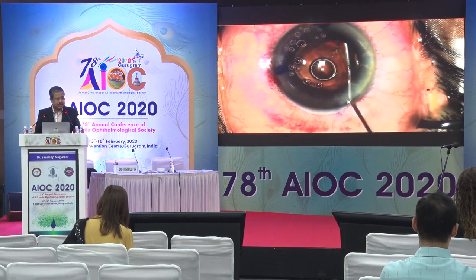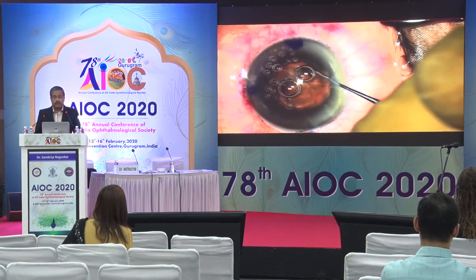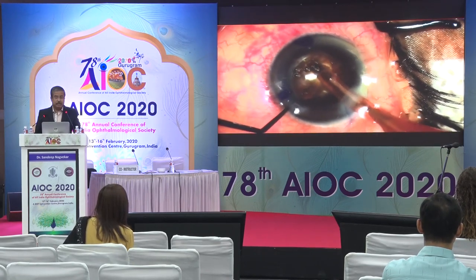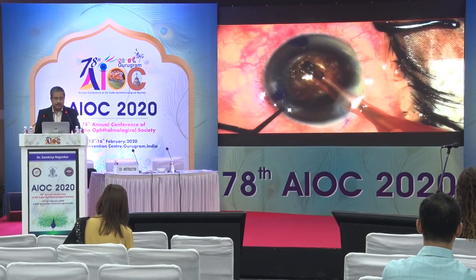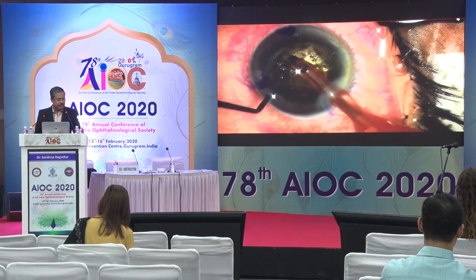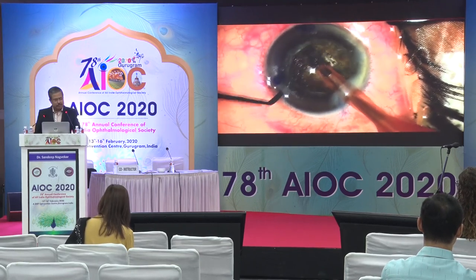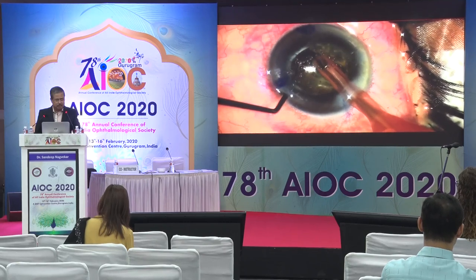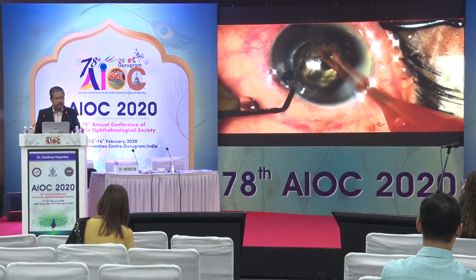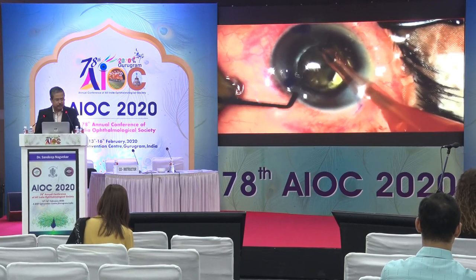In the next case — a 72-year-old with a quite hard cataract — when the posterior capsule is not visible, it's easy to make a mistake. If you do a violent hydro dissection there can be a blowout of the PC. Make sure to do a gentle, multi-quadrant hydro dissection. Go deep down until you see those leathery fibers at the base. When separating, hold with very high vacuum so you do not slip, but do not stretch too much because you are laying stress on the zonules.